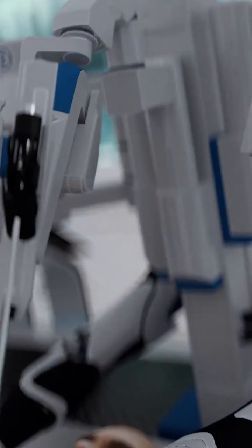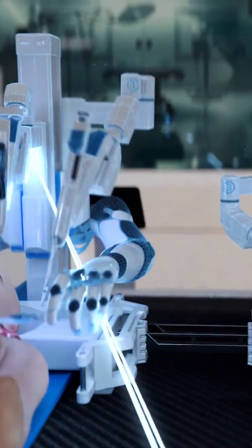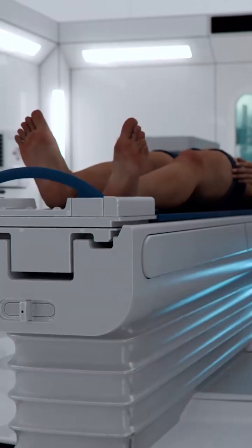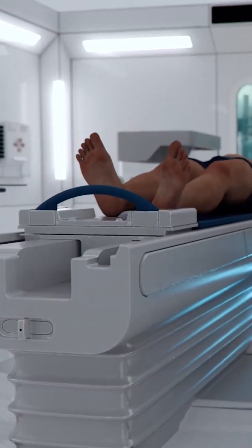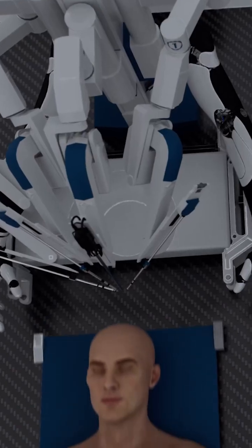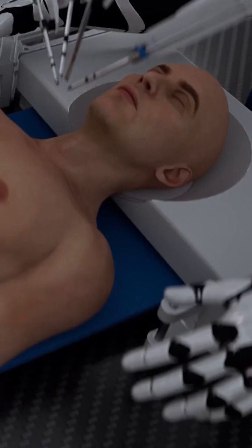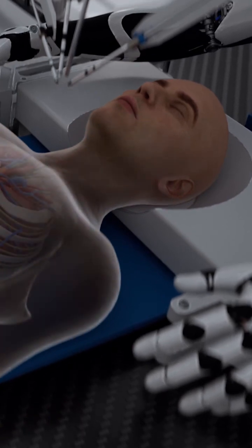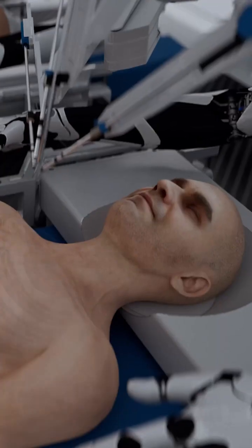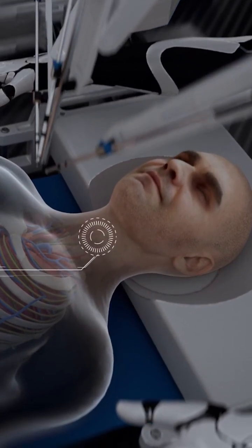The BrainBridge concept involves the use of an integrated robotics platform comprised of two autonomous surgical robots, designed to perform simultaneous surgeries on two bodies side by side within a single setup. The complete robotization of the process allows for the surgery to be performed in an environment with varying temperature and pressure. The procedure begins by preparing the donor and recipient bodies. The donor is a brain-dead patient who has a functional body with vital organs in good condition, while the recipient is the patient whose head will be transplanted onto the new body.